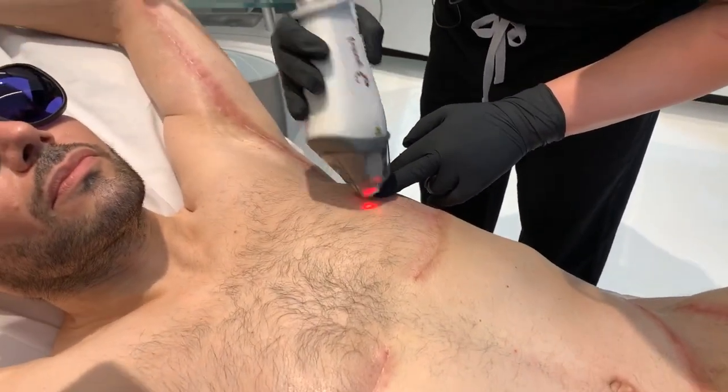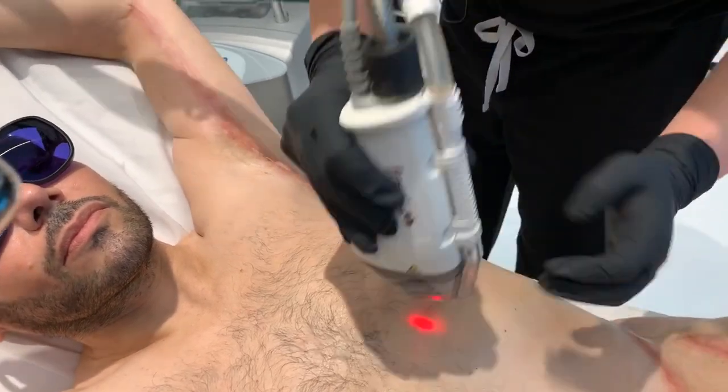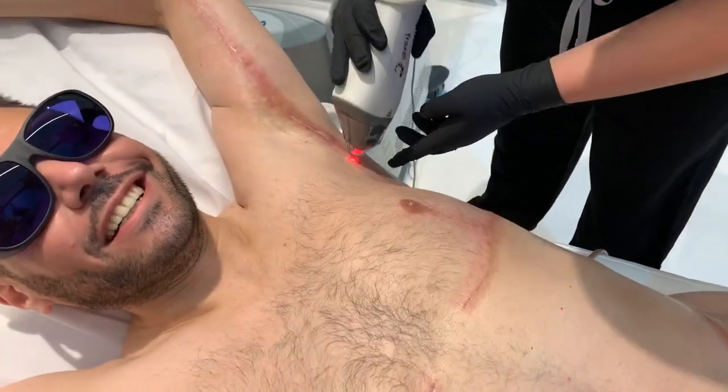Do you use a numbing cream? Yeah, we used a numbing cream beforehand. It still hurts a little bit, and he's super strong. He's been through, obviously, these major surgeries, so he knows about pain. About pain, especially when you do a thigh lift.